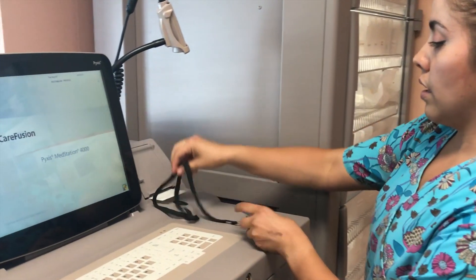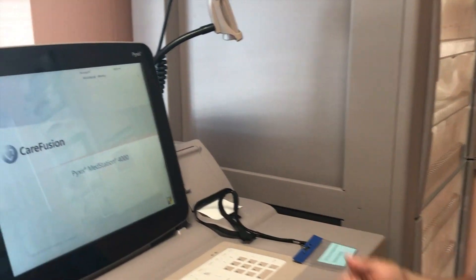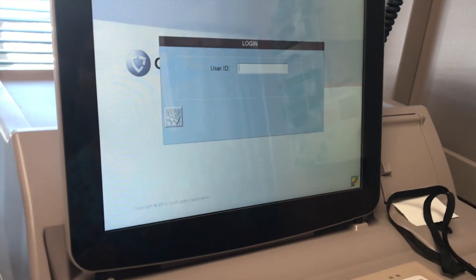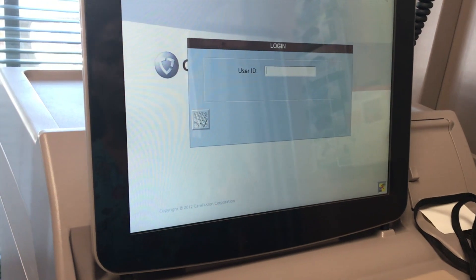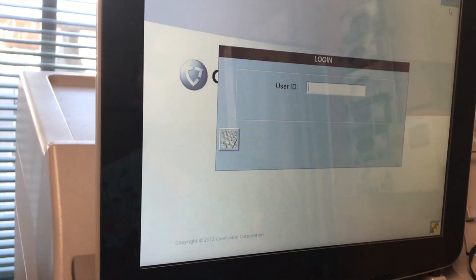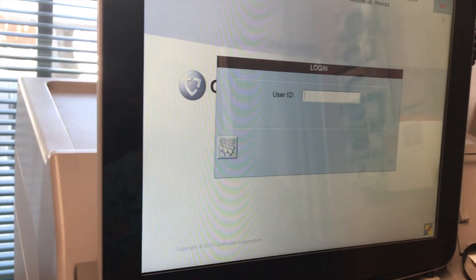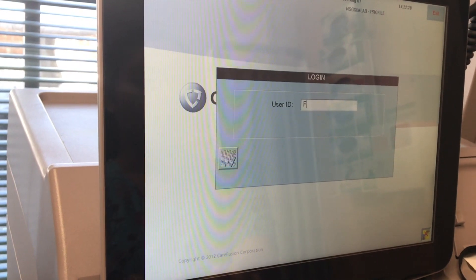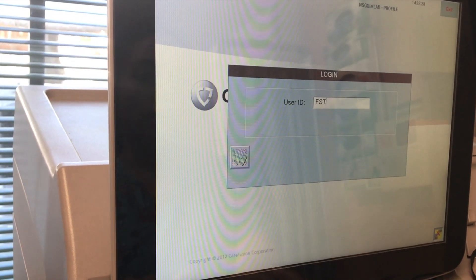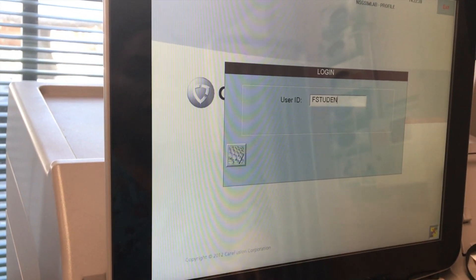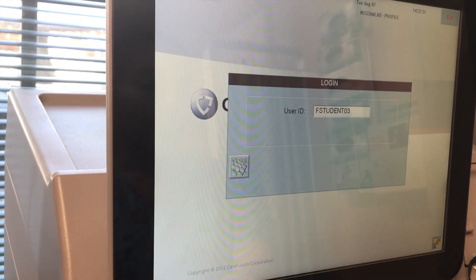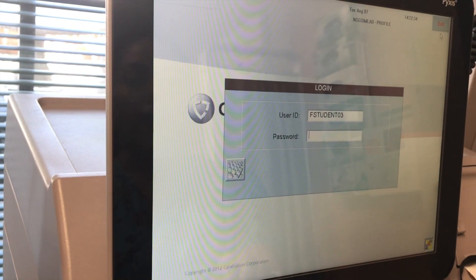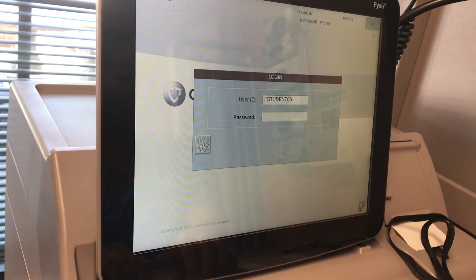So I will be choosing the appropriate medication and withdrawing that from the MedStation Pixis. Using my username and password assigned to me, I will now sign into the MedStation Pixis. I press enter. The MedStation machine allows me to put in my username — this one is Fstudent03. Press enter. It asks me to type in my password.